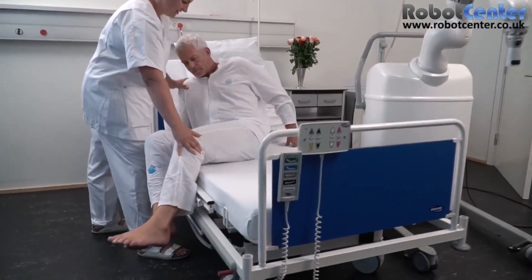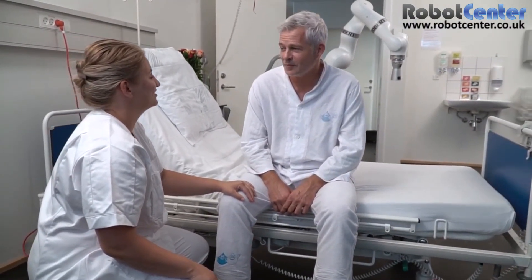Robert is on an important mission: namely to upgrade patients' early mobilization, to improve the healthcare staff's working environment, and to achieve increased patient flow.